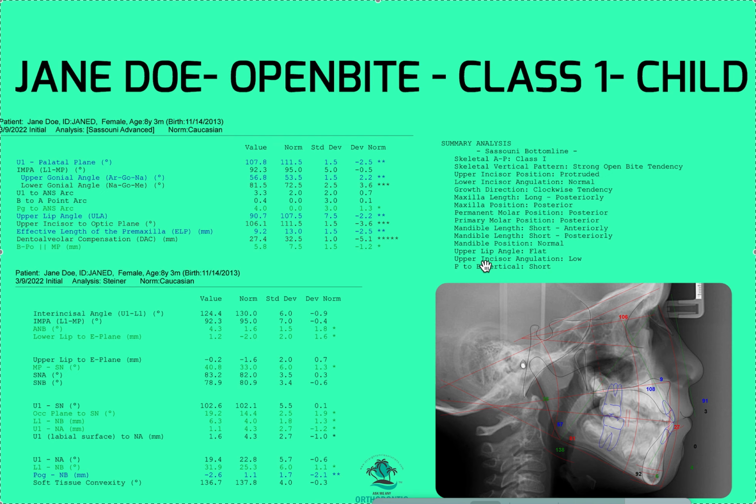Whether you need it on every single Invisalign case is a different story. You need to go by your own standard of care, your own dental practice act in your state. Most orthodontists do take them on everyone just because it's so easy and it's just part of the protocol. It's almost easier for me to have one on every single case, instead of having the team have to say, do I need one?